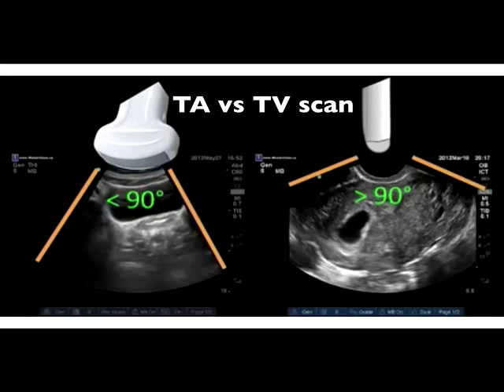One can easily identify a transabdominal scan versus a transvaginal scan by looking at the ultrasound image. If the image is less than 90 degrees, this is from a transabdominal scan, which you can see on the left side of the screen. If the angle is greater than 90 degrees, like the right side of the screen, this is from a transvaginal ultrasound.